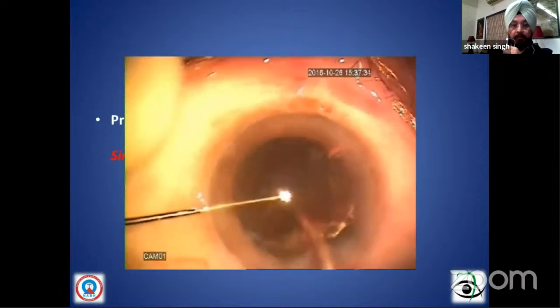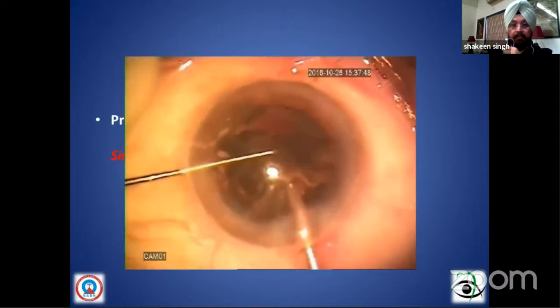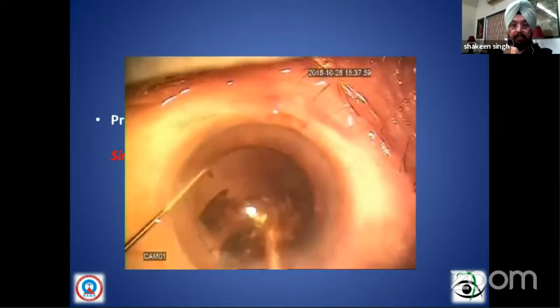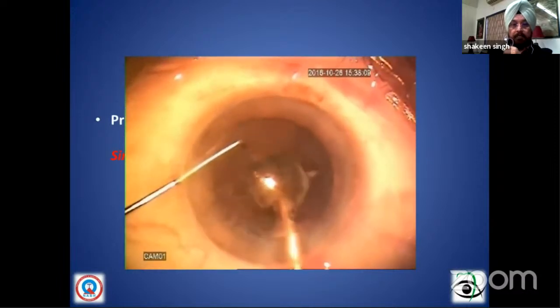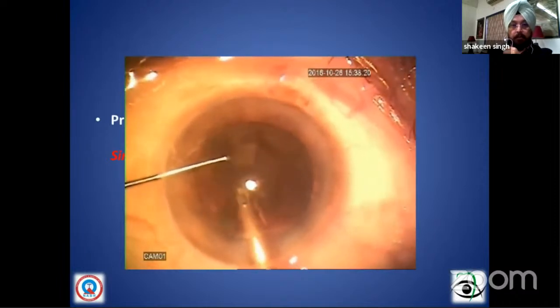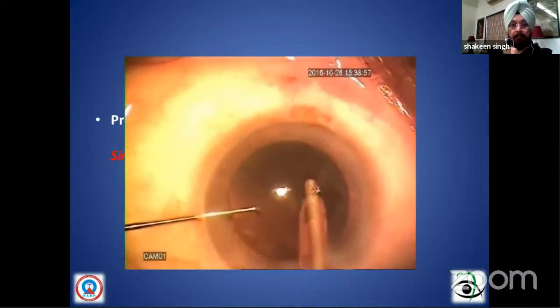These nuclei are different from the normal nuclei, which are harder, and they are leathery, and would not be easily torn away or eaten away. Luckily, the nucleus which I'm sharing is not that leathery, but in a few cases they really trouble you, and for those we have different techniques. Less of the cortical part would remain here because there are very thin remnants.